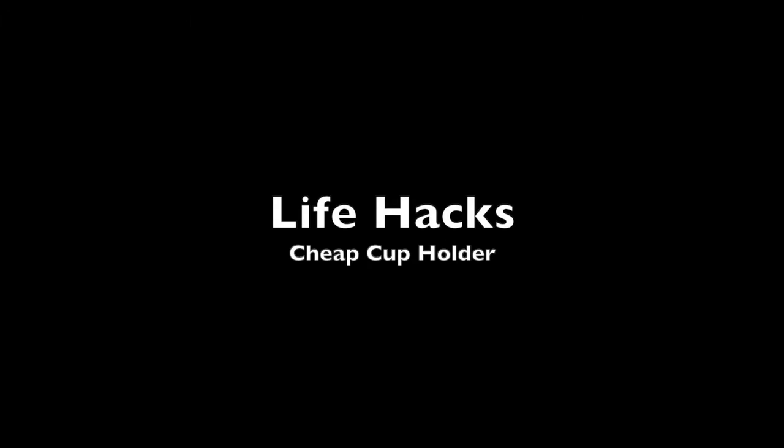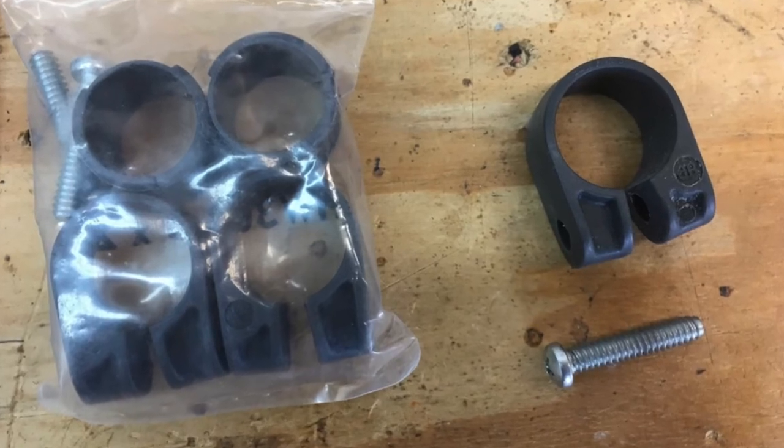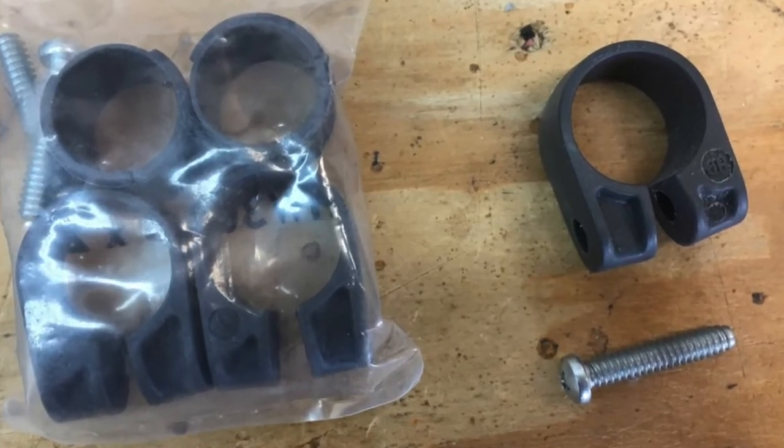How to make a cheap wheelchair cup holder. Step 1: Get a frame saver clamp. They cost about 10 bucks from a wheelchair store.